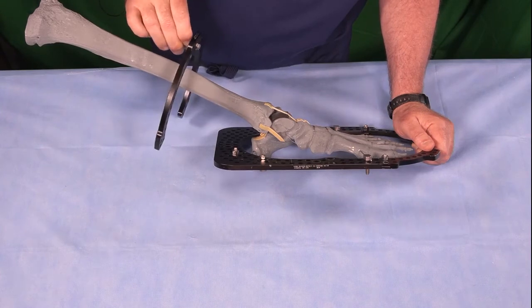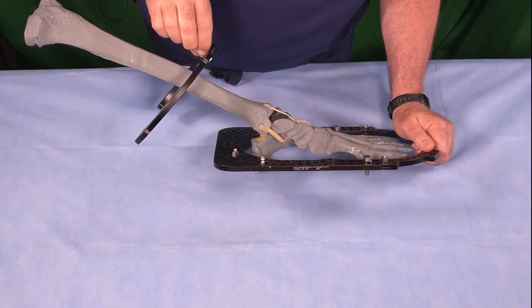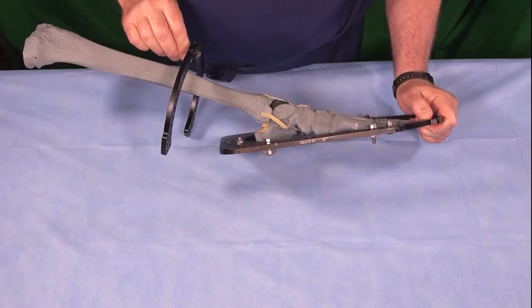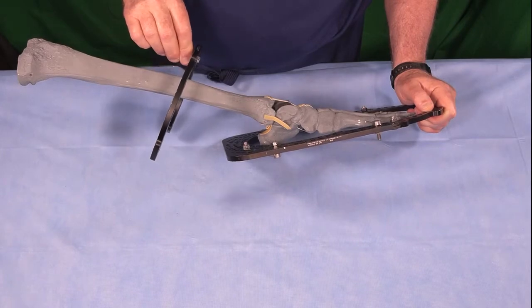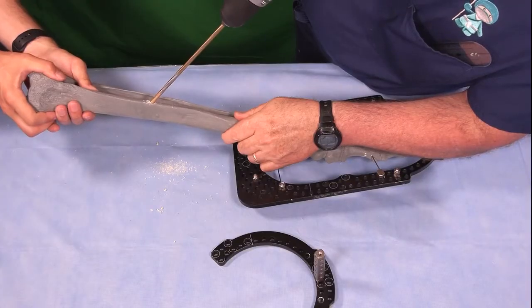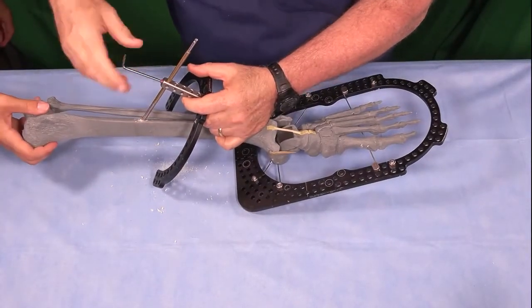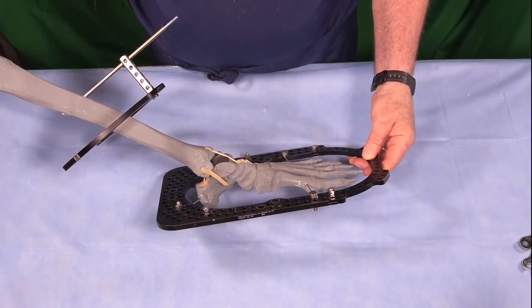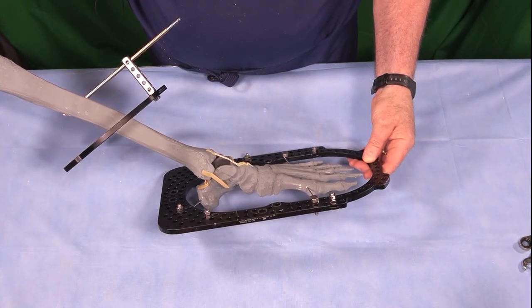This one will be oblique. So rather than place this perpendicular to the tibia, I'm going to tilt it a little bit forward to give me a little bit more room to place my struts in the back and a little bit better mechanical advantage in pushing. For less severe cases of Equinus, I would feel very comfortable placing this ring perpendicular to the long axis of the tibia. But for this hyper Equinus case, I'm going to tilt it forward. So I've applied this proximal ring intentionally at an oblique angle to make my frame biomechanically more advantageous.